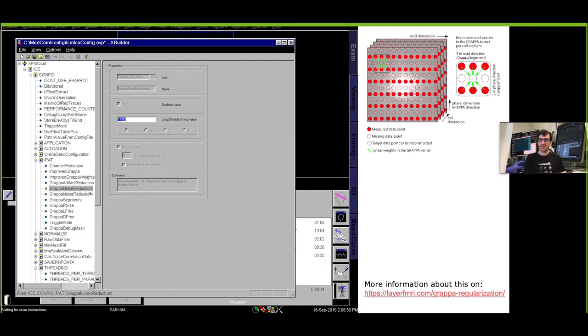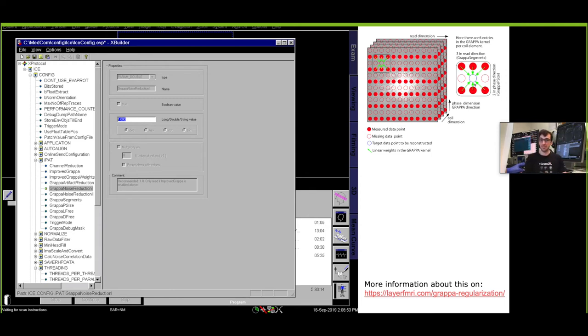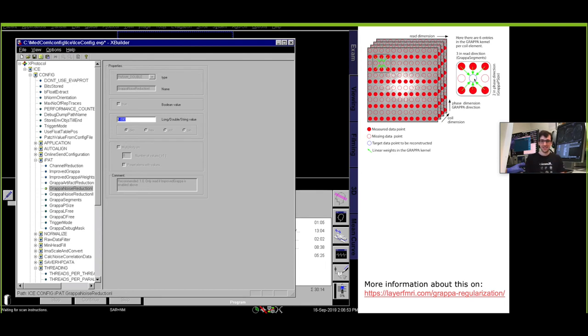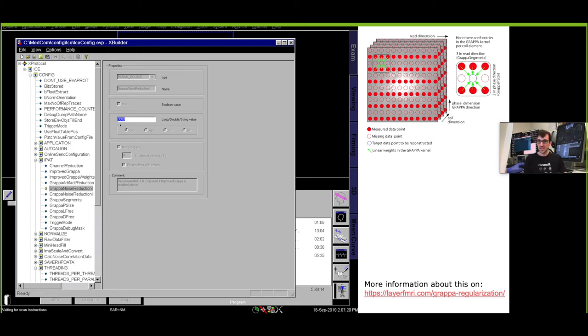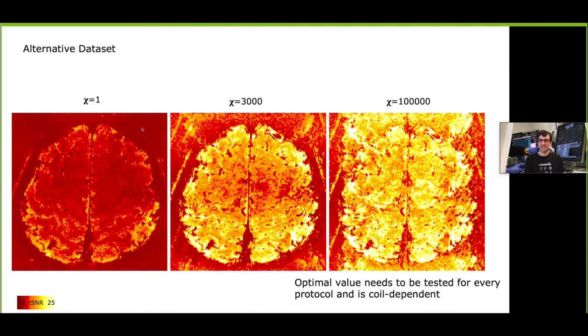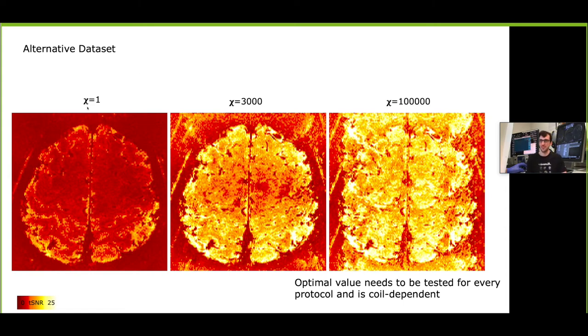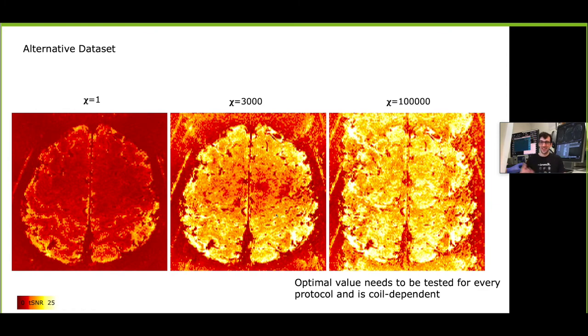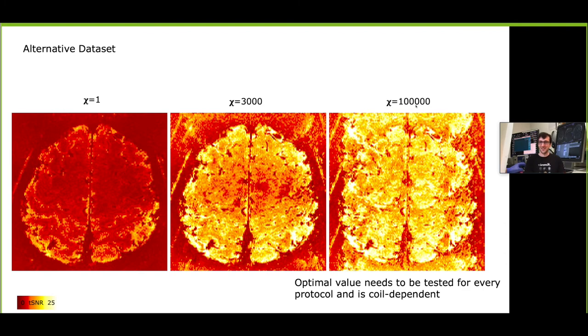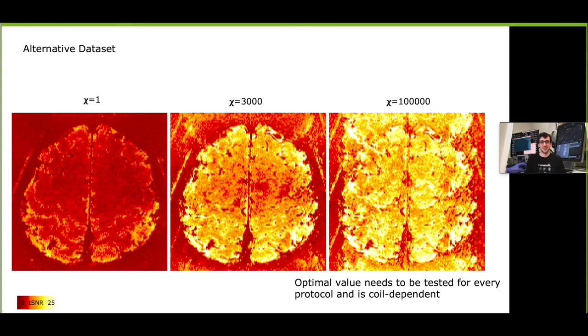This basically determines how similar neighboring k-space points can be in the GRAPPA kernel fit to reconstruct missing k-space points based on a kernel that has been acquired and fitted in reference data. This has a huge effect and I usually change it from one to something like three thousand or five thousand. There you can see that the tSNR is hugely improved. The default of regularization of one here is barely exceeding the double digit regime of tSNR values, but going to three thousand it's improved by a factor of like two or three depending on the protocol coils that you have. Obviously you can also over regularize it by increasing it by a factor of a hundred thousand and then you're basically copying k-space lines, make them very dependent, and then you're not doing GRAPPA after all and then you have huge ghosts.